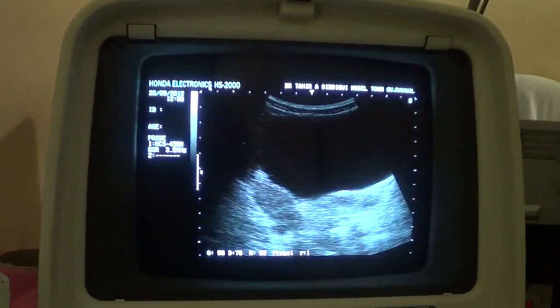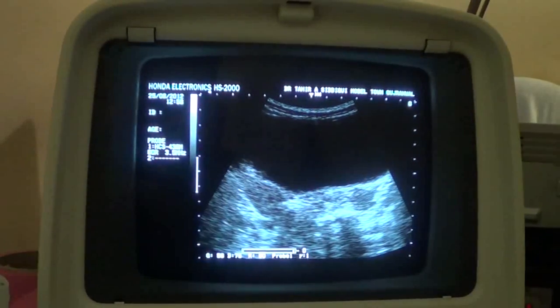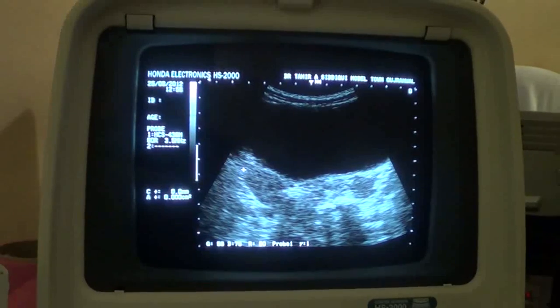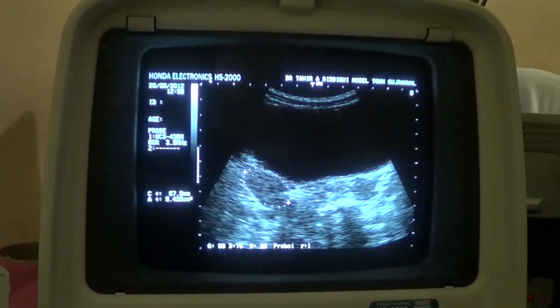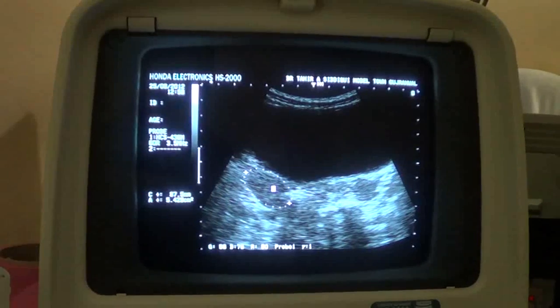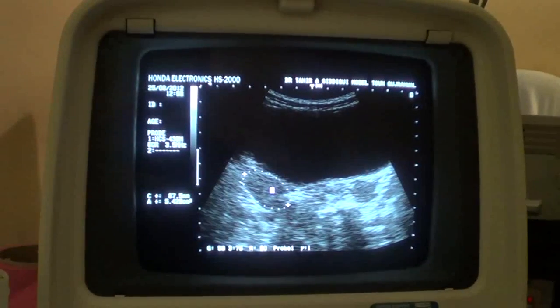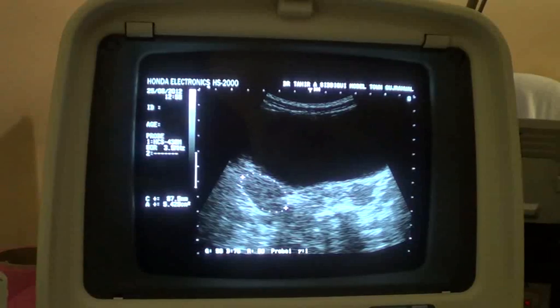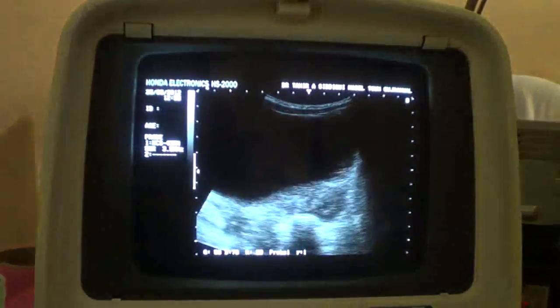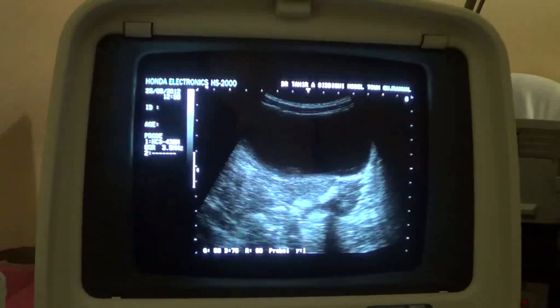Now this is the right ovary. We can see a tiny cystic area which is the developing follicle. So the ovaries are normal in size and both ovaries show follicular activity.